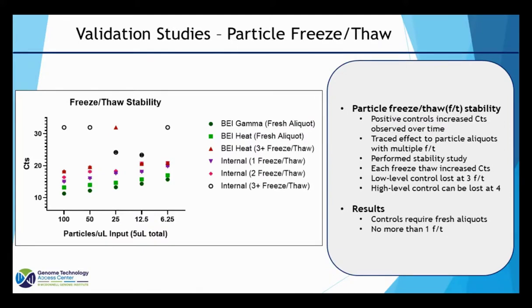Okay, so the samples are fairly stable for a good period of time, even up to fairly warm conditions, as long as you don't get very warm. Hot, like I said, is the equivalent of being inside of a locked hot car for more than 8 hours. But that gives us good confidence that these samples will be quite stable for transport, assuming you don't have extreme conditions for very long periods of time.